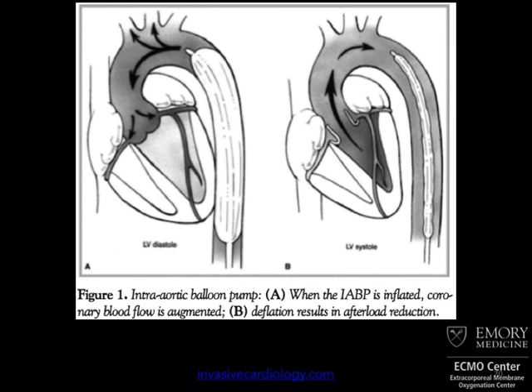The intra-aortic balloon pump technology was developed in the 50s, and essentially it increases diastolic filling pressure to help improve coronary perfusion, and the balloon then deflates in systole to allow reduced afterload and increased flow. It was felt that this technology was the standard of care and would never actually be put into a trial, and that it must certainly help people that were in cardiogenic shock after myocardial infarction.